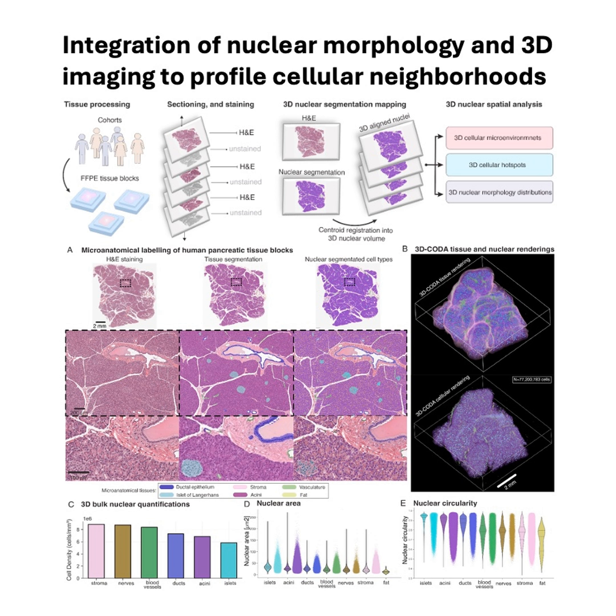Okay, let's do a quick recap for part 2. This team developed this amazing pipeline. Slice the tissue super thin, digitize it, digitally restack it perfectly in 3D, use AI to map out all the tissue types, use another AI to find every single nucleus, extract detailed features from each nucleus, and then link everything together in that 3D space. That sums it up nicely.